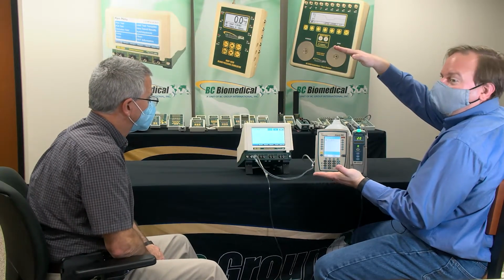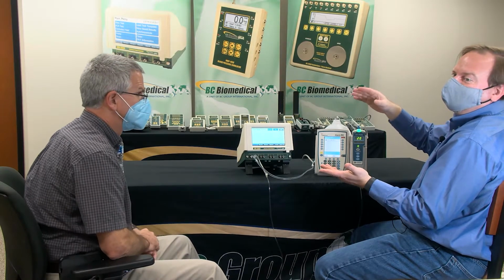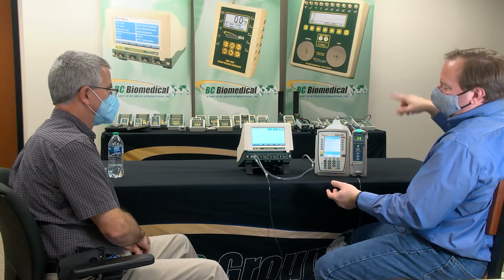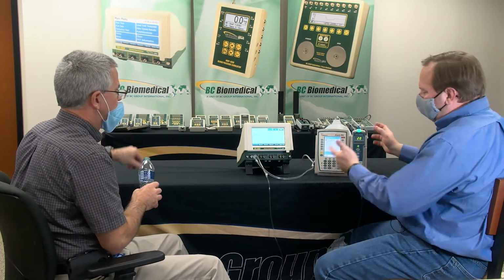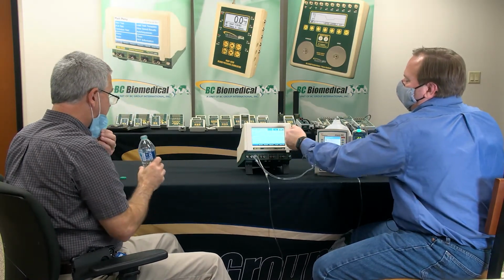So the PCA test is showing you instantaneous flow rate, because when you're going from 20 to 100, that average is going to take a long time to get up, which doesn't really make sense. So it's just showing you instantaneous flow rate, and that's all the little blips and loops that it's got. So anyway, this was the first bolus, the second bolus, so it'll keep moving these down.